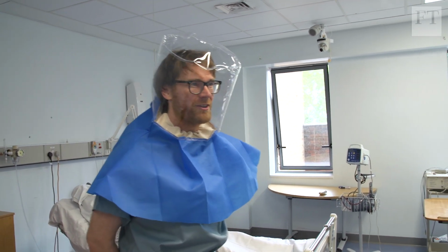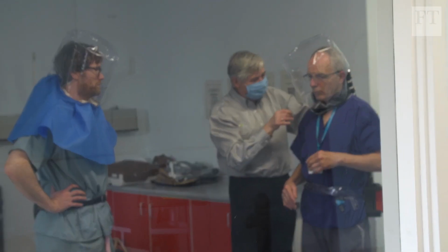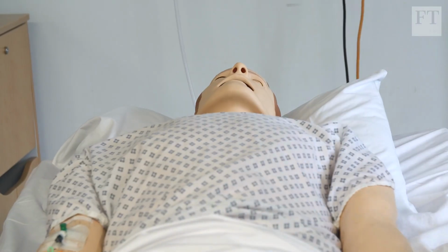Yeah, the acoustics is very good. Each of Mike's pressure hoods will cost around £300 to £500, depending on the number produced. Is that okay, fit-wise? But he believes the safety benefits will pay off. No gaps for contaminated air to get through, no pressure sores, improved comfort and communication.